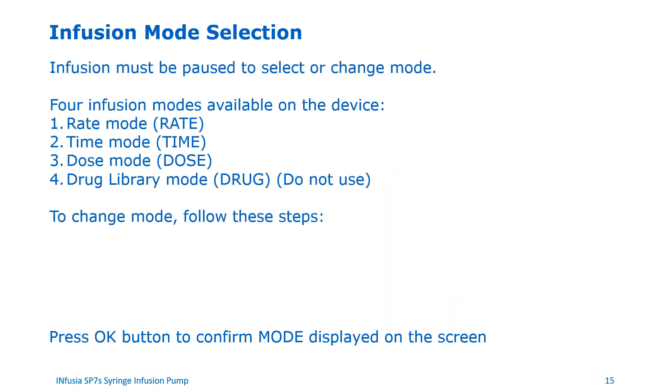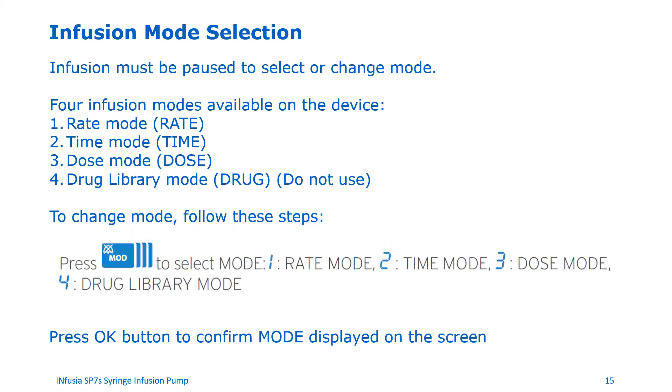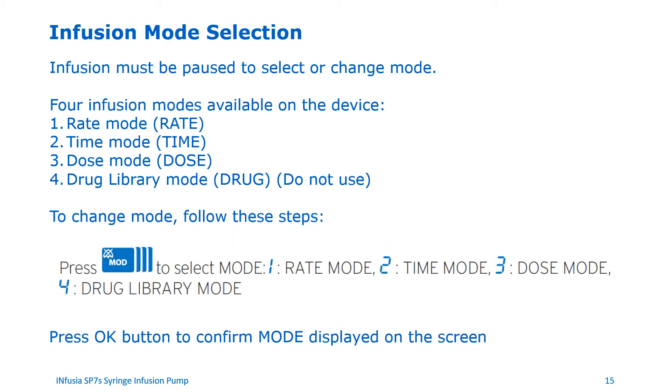Let's discuss mode selection. Please note the infusion must be paused for mode selection to be available. You cannot change a mode on this device when an infusion is running. There are four infusion modes available on the device: rate mode, time mode, dose mode, and drug library mode. The drug mode comes with a pre-populated set of drugs. We do not recommend using this mode for veterinary use as this drug library is very rigid and cannot be configured for different dose rates. To change mode, press the MOD button. Pressing it once gives rate mode, twice gives time mode, three times gives dose mode, and four times gives drug library mode. Press the OK button to confirm the mode displayed on the screen.